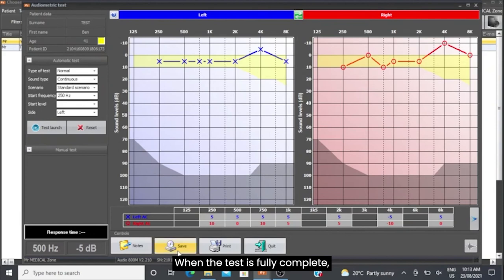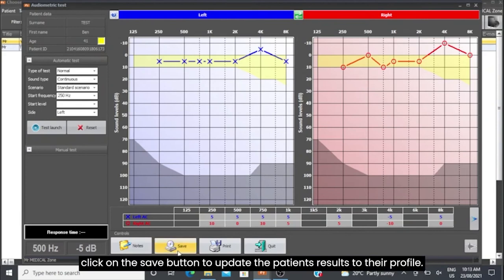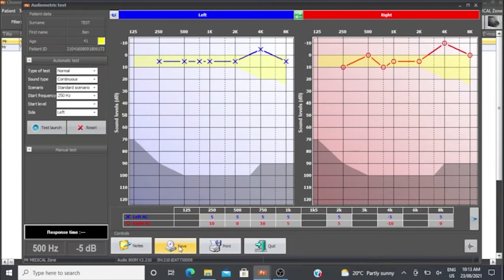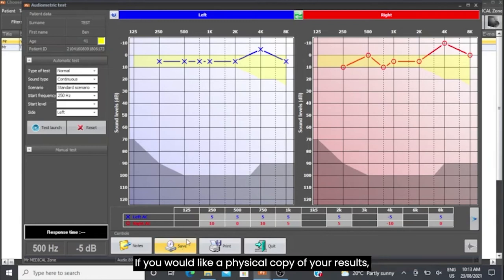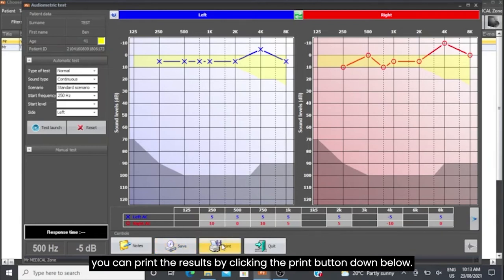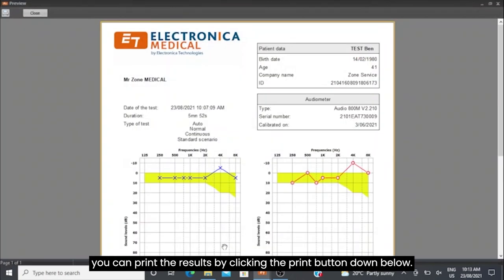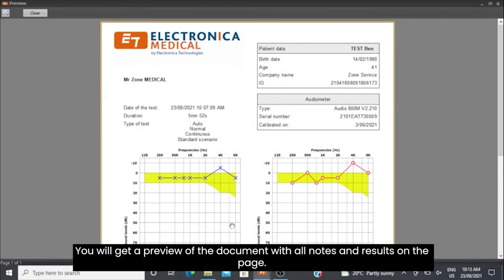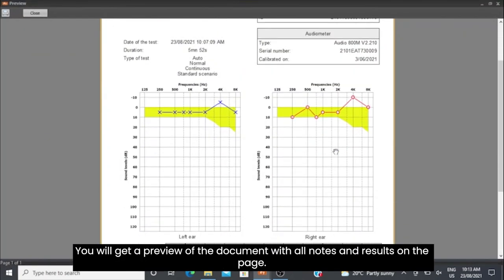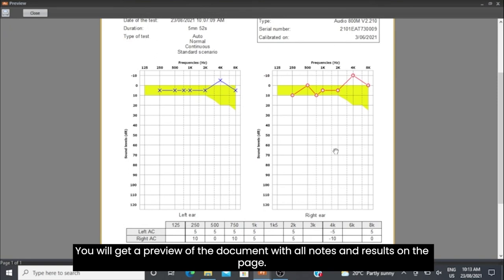When the test is fully complete, click on the Save button to update the patient's results to their profile. If you would like a physical copy of your results, you can print the results by clicking the Print button down below. You will get a preview of the document with all notes and results on the page.